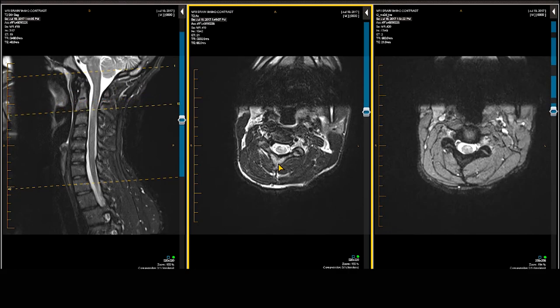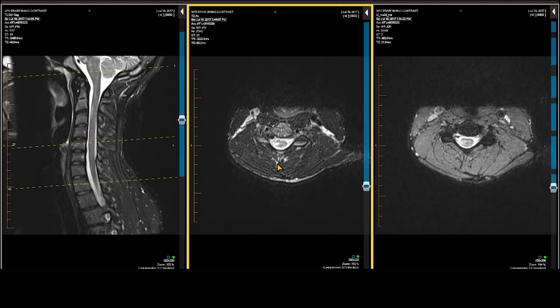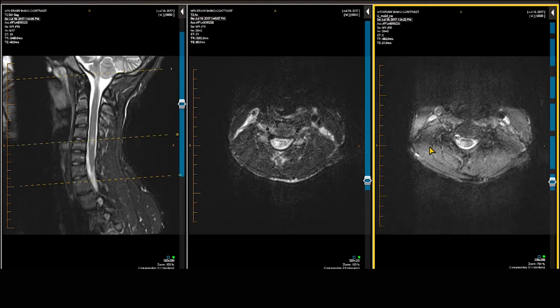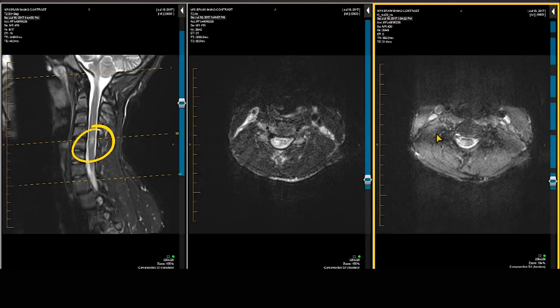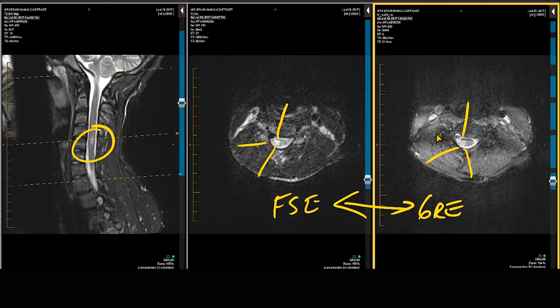The patient was moving, so it is not the best study. However, when we get down to where that large plaque was, we can see it was affecting the right side of the spinal cord. Here is the demyelinating plaque at the C4-5 level — bright signal intensity in the spinal cord on the fast spin-echo motion-degraded scan, and also on the gradient echo scan. Both sequences should be included in the axial plane for the cervical spine.